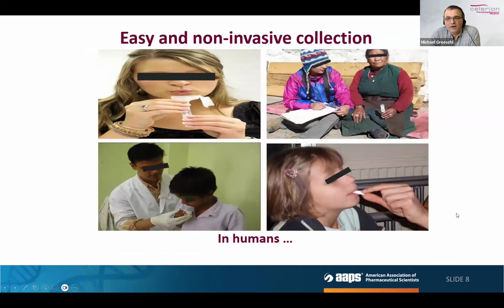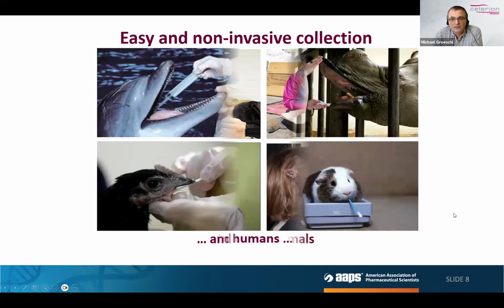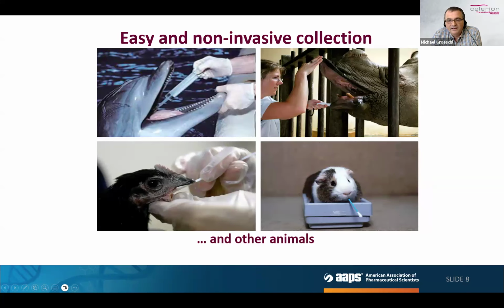One key advantage of saliva collection compared to blood sampling is its simple and non-invasive way of sample collection, which can be performed by non-medical personnel, even by the patient themselves, even in areas far away from medical facilities. Saliva analysis is particularly accepted in pediatrics and increasingly also in geriatrics, where blood sampling is technically challenging. Saliva is also increasingly being used in behavioral research and reproductive medicine in zoological gardens.